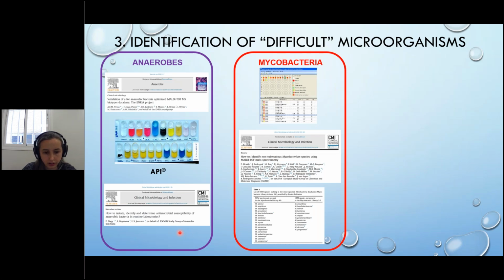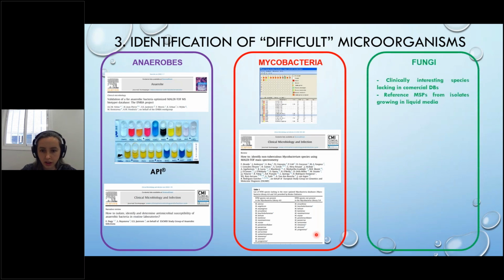So the table at the bottom shows just a few missing species among the more than 200 mycobacteria species that are described so far. Different groups collaborated and tried to standardize the known methodology for the identification, but it was more from the laboratory side, since the different manufacturers had done their homework.